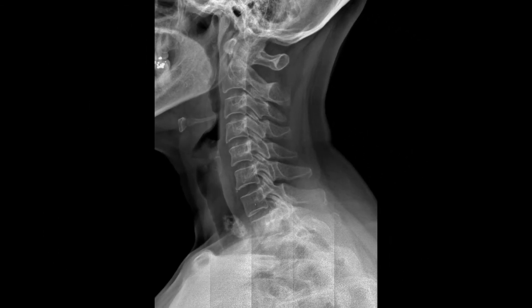Here is another example of a calcific thyroid density or cyst. Again, this would need to be followed up — this is abnormal. The calcific density in the thyroid is abnormal; the hyoid bone is normal.